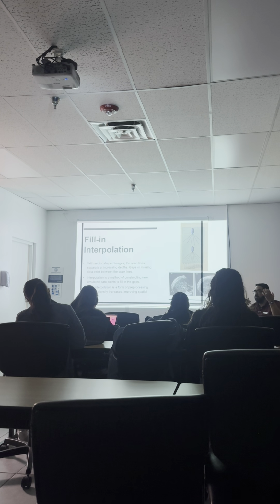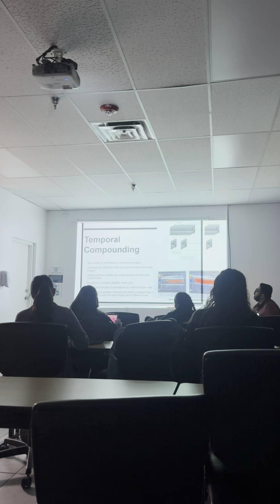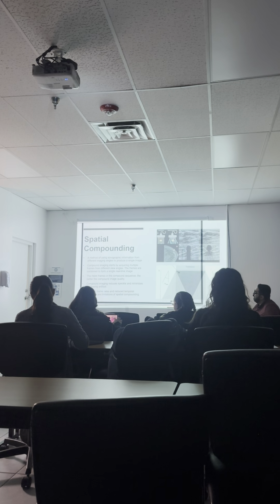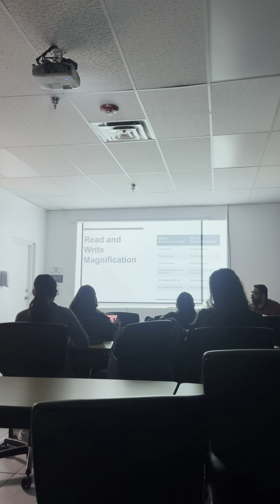Just like some of you mentioned last week, it's a game of give and take. You never have the perfect settings for everything. When one improves, the other one decreases, and vice versa. So: fill-in interpolation, temporal compounding, edge enhancement, frequency compounding, spatial compounding, coded excitation, and read and write magnification.